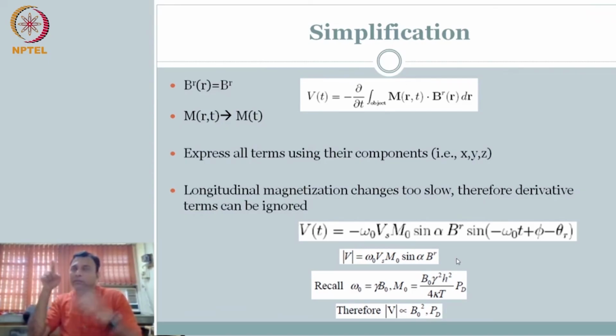We talked about applying another rotating magnetic field with the same frequency, then you can manipulate this magnetization vector. So now you get that insight. Now we can manipulate the transverse component. So we need to add one more rotating magnetic field to manipulate this alpha. Then we could get signal. So we need to add to our signal equation, the motion equation. What happens? We add an additional rotating magnetic field.